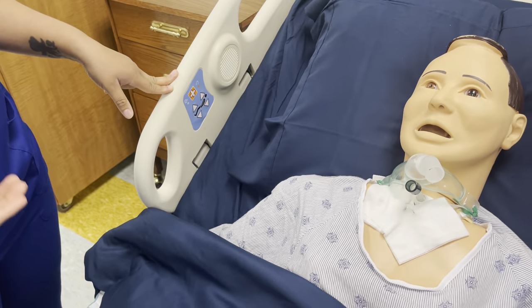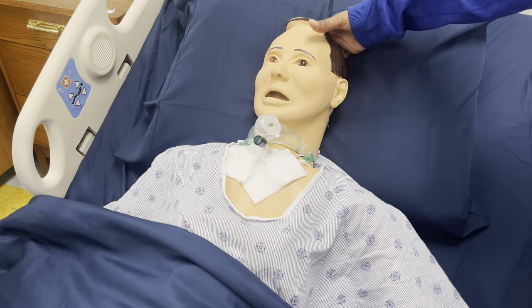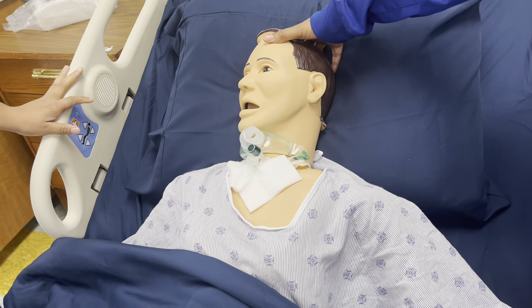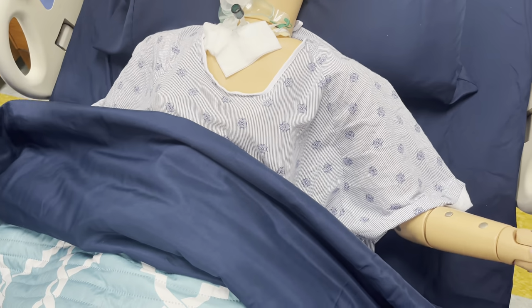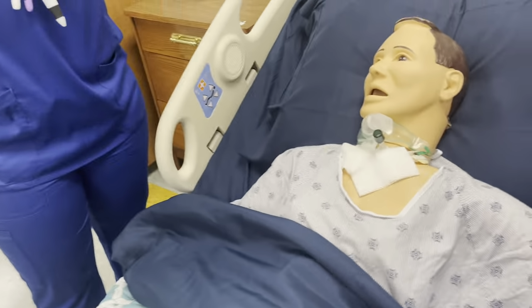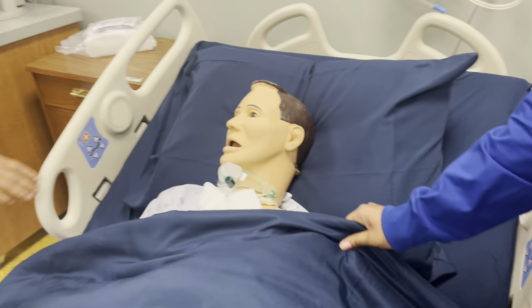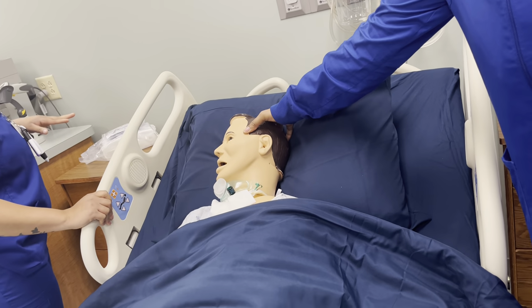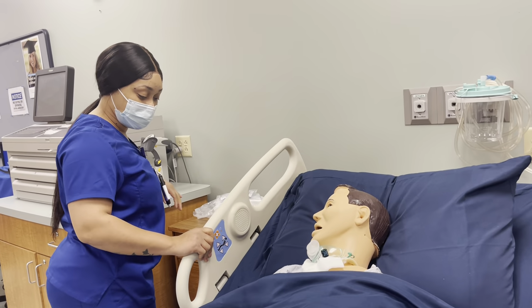I'm going to have you raise your hand whenever there's discomfort that you're feeling, so I can either stop or let you take a breath and start back in. Can you identify your name and date of birth for me? Okay, Mr. Manning, we're going to get started. Let me adjust your bed. You're going to stay in the same position that you're in.